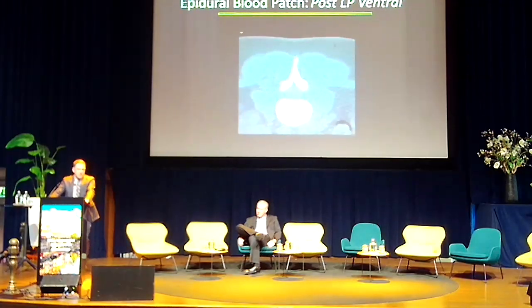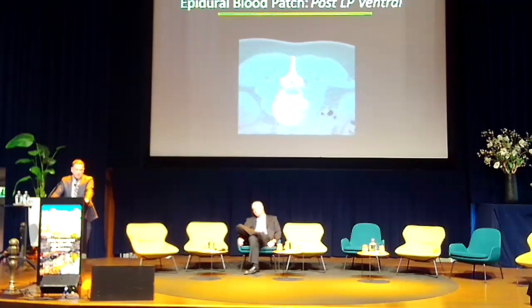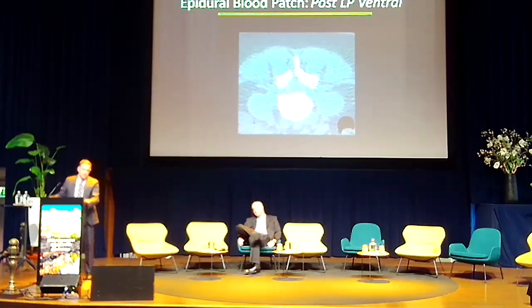And what we tend to see at Duke is an awful lot of patients that are refractory to multiple prior blood patches. And this technique has been helpful for us in those cases because presumably what's happened is the patient has had a disruption of the ventral dura. And so here we use CT guidance in order to place needles to the ventral aspect of the epidural space in the spinal canal. And this technique was first published a long time ago, for the thoracic spine, applying for SIH and trying to treat disc osteophyte leaks.